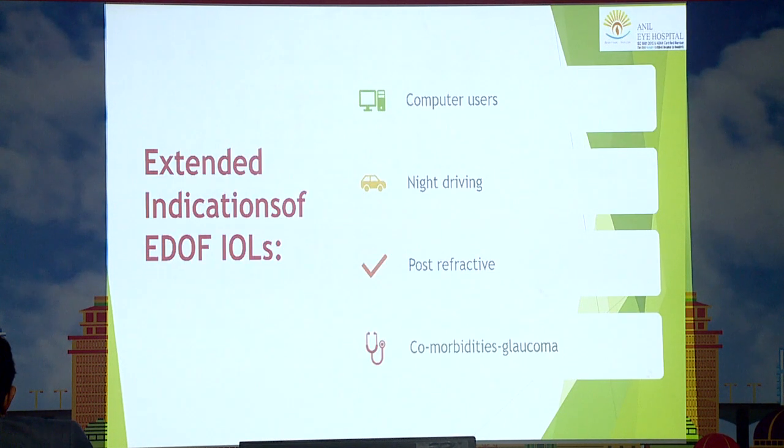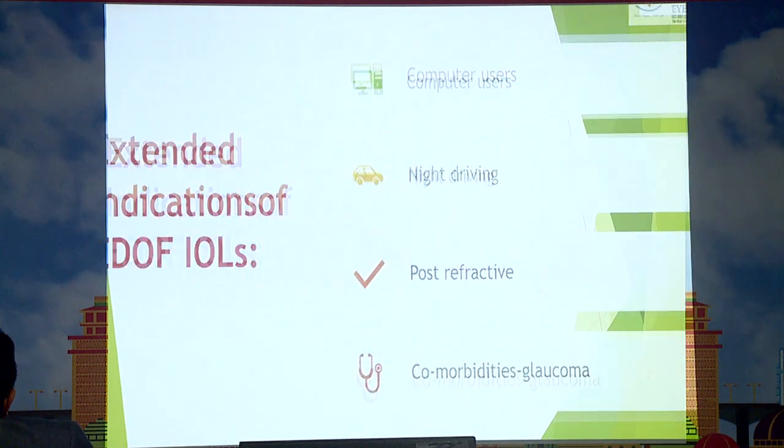So the extended indications, especially in my practice, are for computer users, those who are doing night driving, post-refractive patients, or those who have mild comorbidities. You can think of doing the EDOF lenses, but yes, many of them need a reader, so you have to tell them that you might need reading glasses.